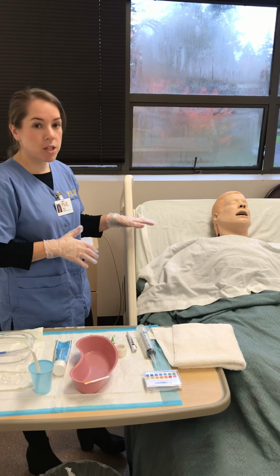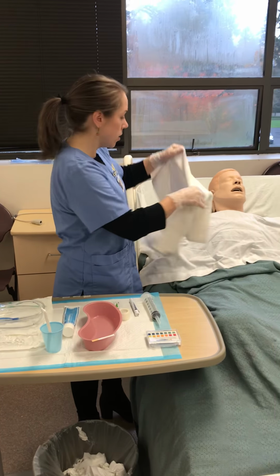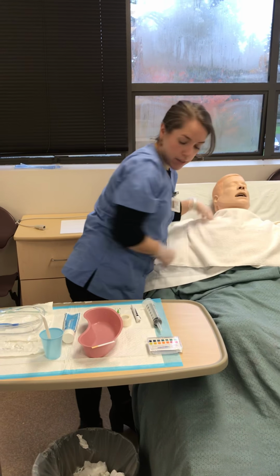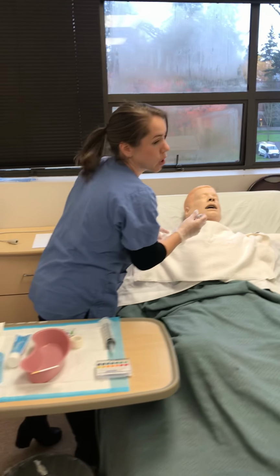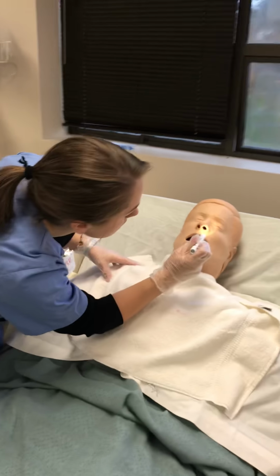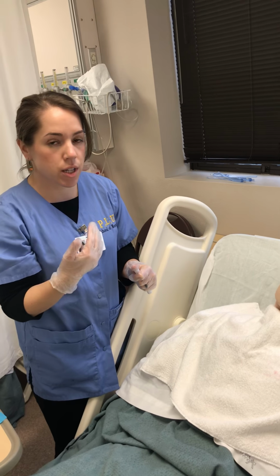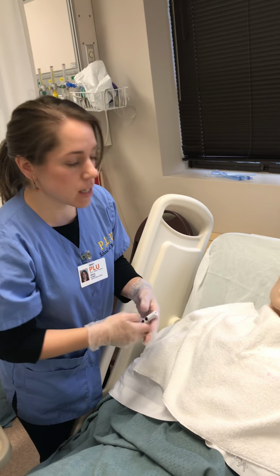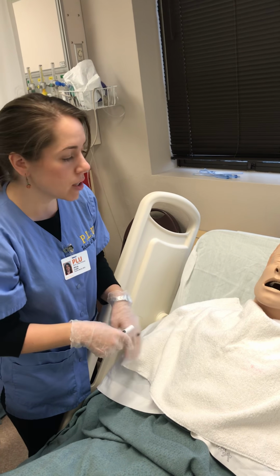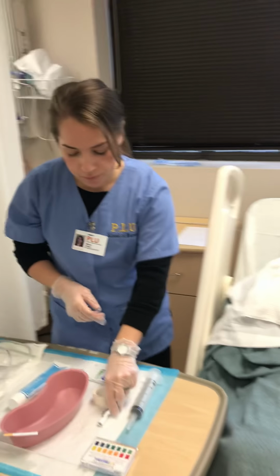So I've made sure the patient is in a high Fowler's position. I'm going to cover them with a towel. And then I'm going to start by looking into their nostrils to see which one is larger. Okay. And then I'm going to ask the patient to occlude one nostril at a time and blow out so I can see which one is more patent, and then we'll put the tube into that nostril. For demonstration purposes, we'll do the right nostril.